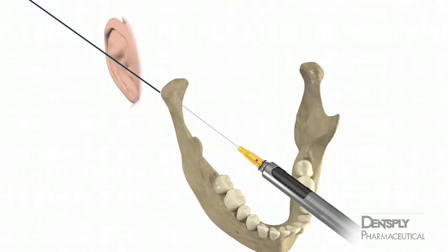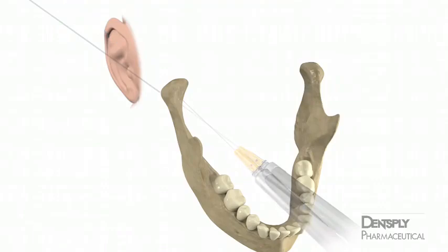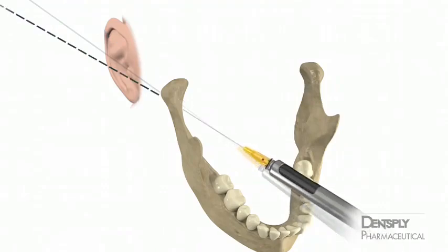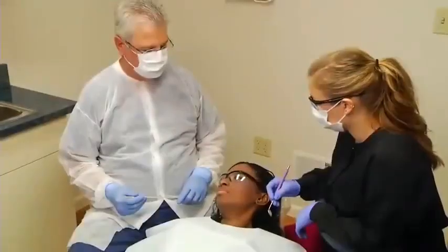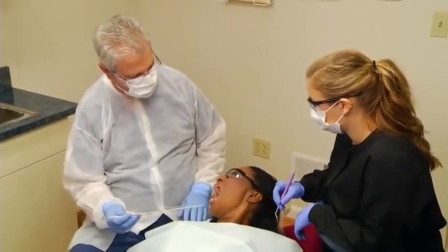Normally, the barrel of the syringe is placed over the contralateral canine. For a tragus that lies flat against the face, the syringe will be located anterior to the canine. With a divergent tragus, it will be posterior to the canine. The patient is requested to open maximally for this injection.